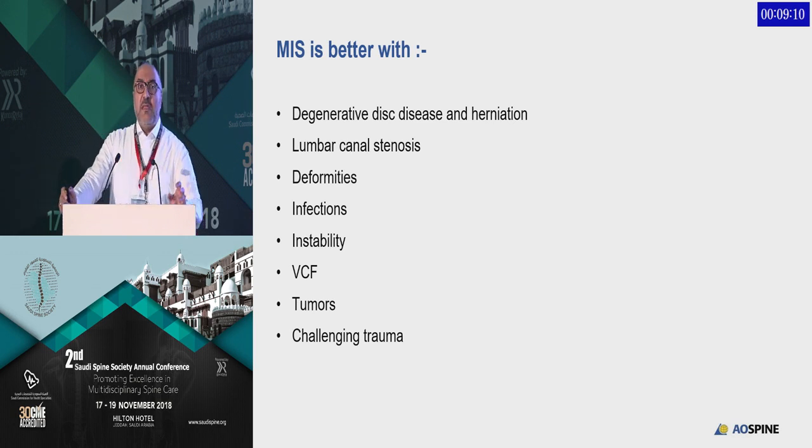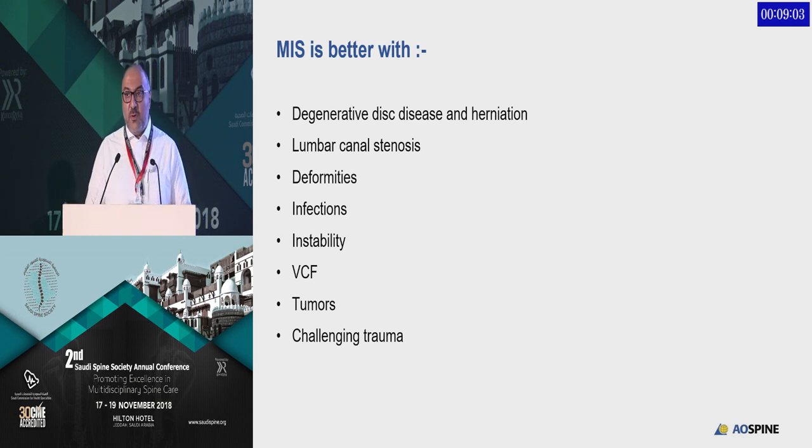When you do also the TLIF in the back, increase the incision. I found sometimes I have a problem when I put the tube, I'm trying to approach and take the facet out and the pars, I don't have enough space. When I cut from the side, about half a centimeter, it gives me a better view.